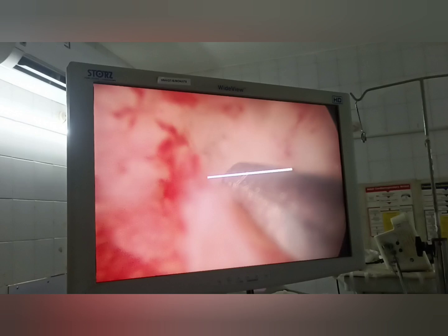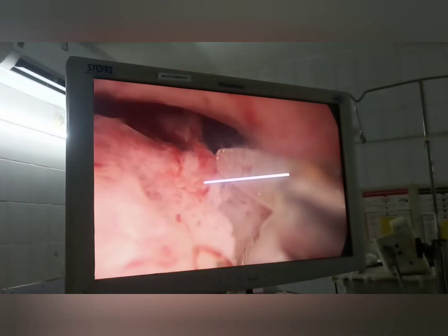If it is a nulliparous female, or a female who is planning pregnancy, and it is a big polyp, then the slicing technique is used, in which vertical cuts are made onto the polyp dividing it into two or three parts, until only a small part of the base is attached and the polyp part is hanging or just floating in the cavity, as you can see.